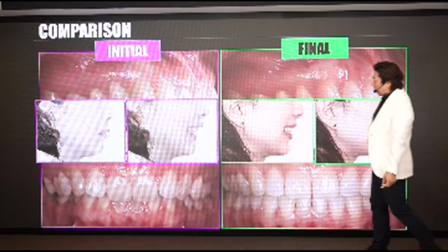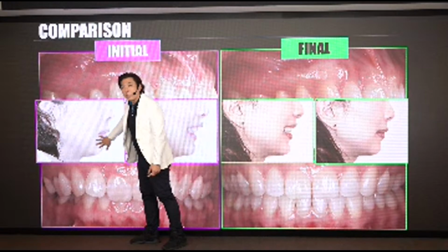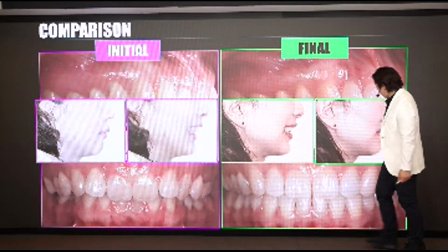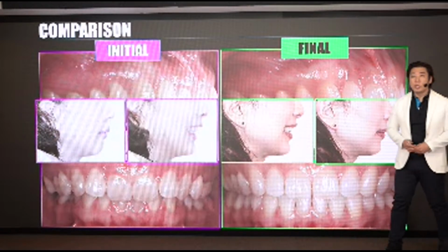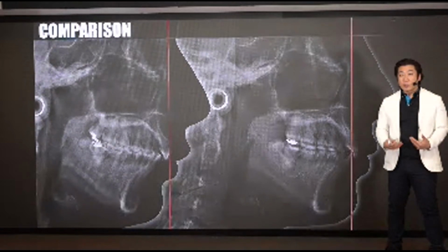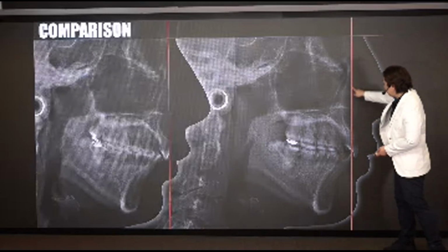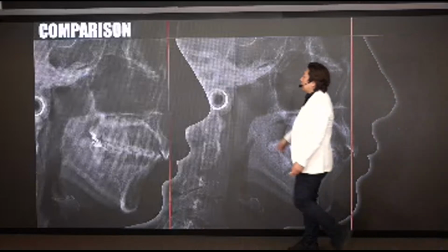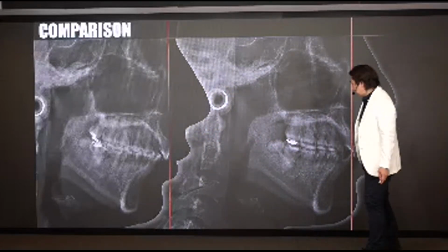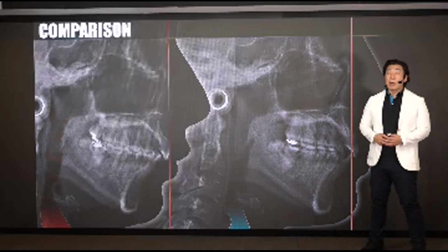Initial and final, how can we change the mandible position? Initially, it is shifted to the back, but finally good smiling and a good profile are achieved. The tooth position is very important, but so are the face, smiling, and the bone situation. You can see here, compare, its anterior positioning is very good. And this is very amazing.